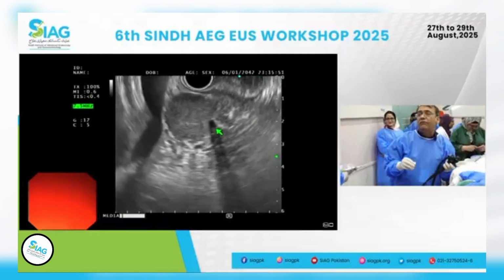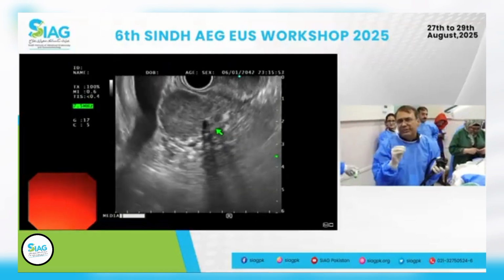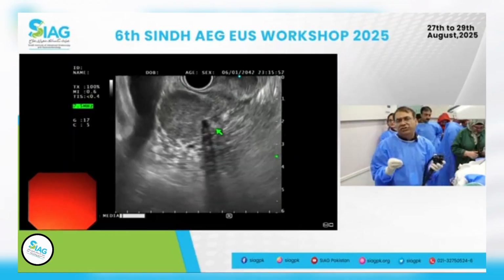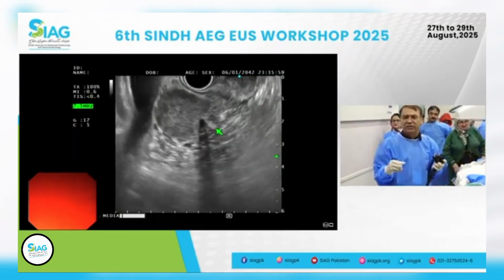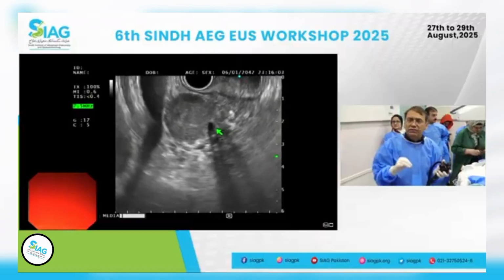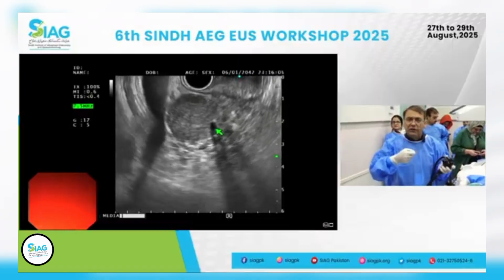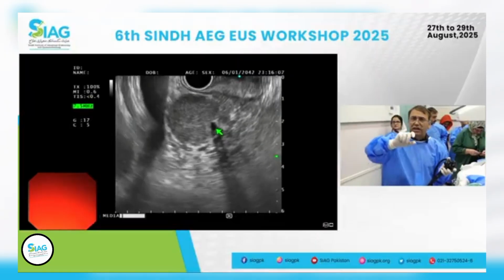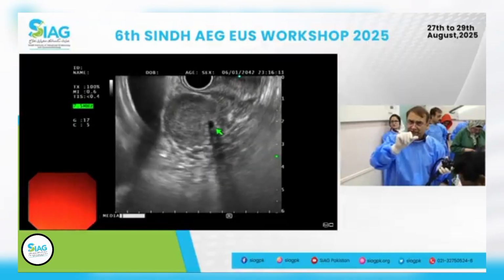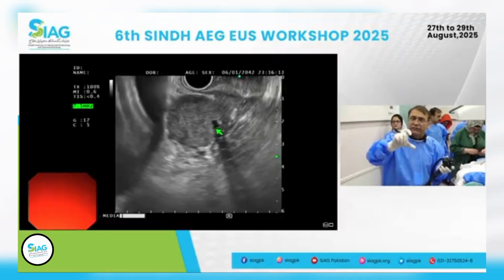So, the other thing I did is I used the suction, but I did not use the full suction. What I mean by full suction is continuous suction. I did not use continuous suction. First I did a few passes without suction, and then a few back and forth with suction, and then I closed the suction again.